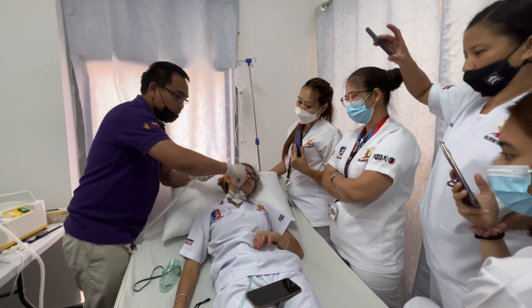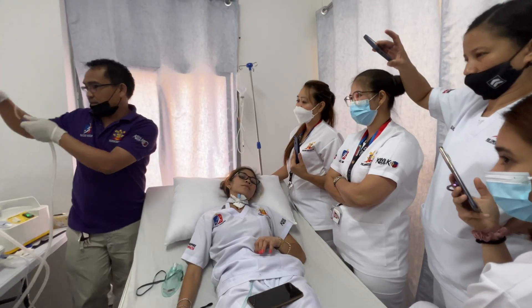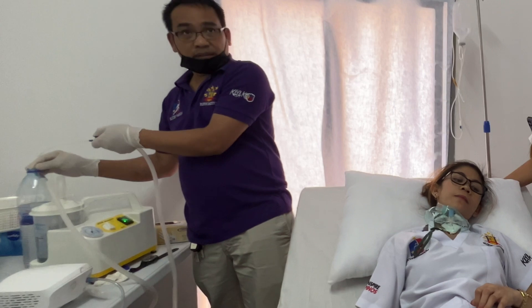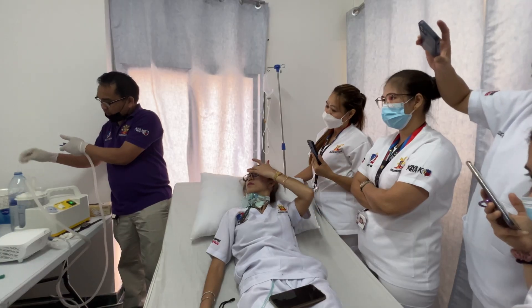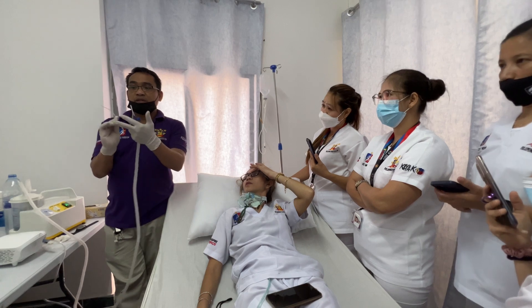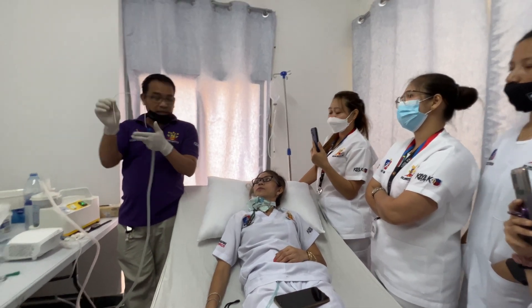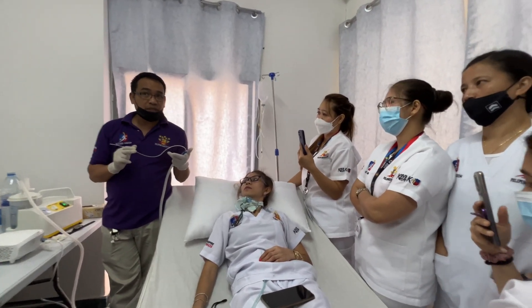After the patient reacts, withdraw quickly, then return the oxygen. You have to rinse the catheter. Why do you rinse the catheter? Just to clean all the mucus inside the tube. That is the reason you rinse the catheter. After five minutes, if you still hear a crackling sound from the lungs, you have to suction again.